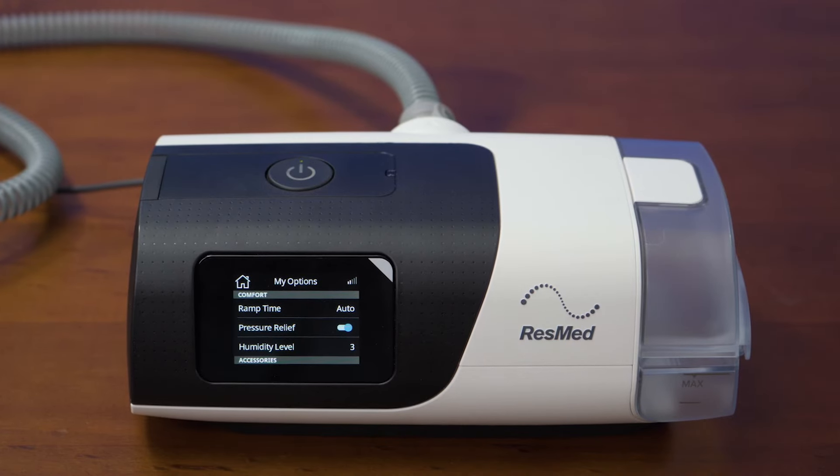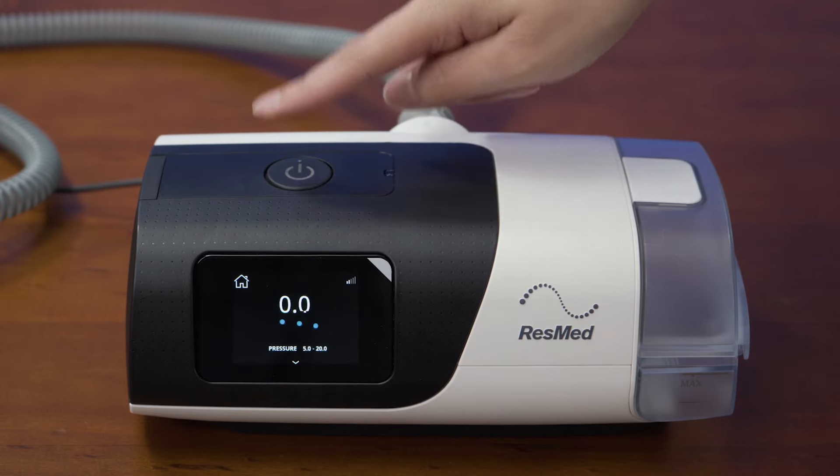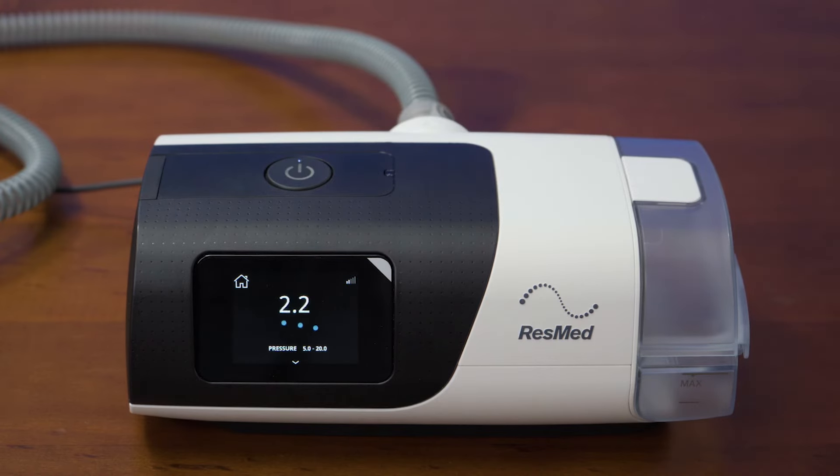In the morning, if there are just a few water droplets in the tubing, this means the humidifier is set appropriately. If there are a lot of condensed water drops inside the tubing and/or mask, it means that the humidifier is too high and should be set lower. Nasal dryness means the humidifier level is too low. The button on the top of the device is the power button — this turns the PAP on and off manually.